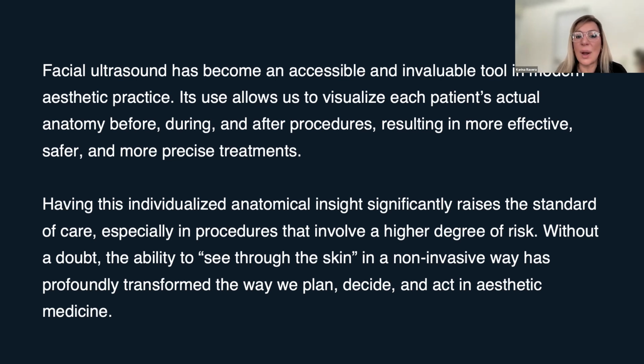Having this individualized anatomical insight significantly raises the standard of care, especially in procedures that involve a higher degree of risk. Without a doubt, the ability to see through the skin in a non-invasive way has profoundly transformed the way we plan, decide, and act in aesthetic medicine.